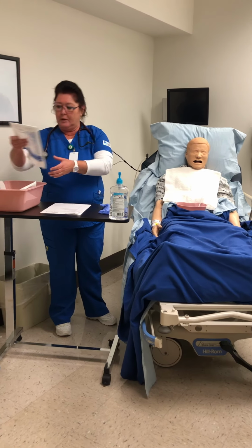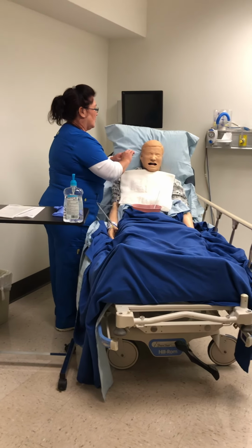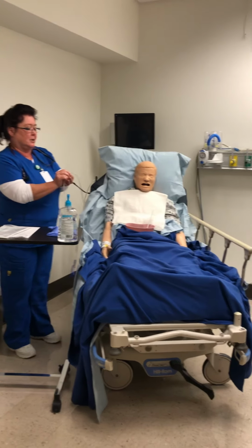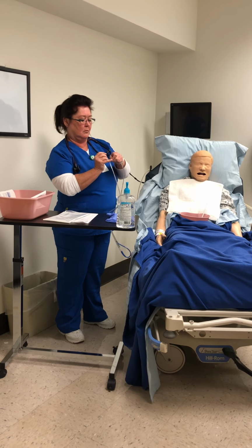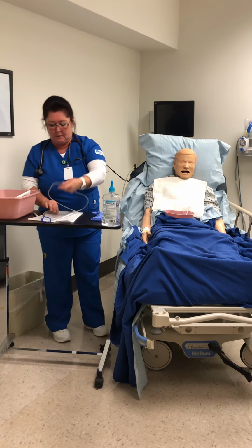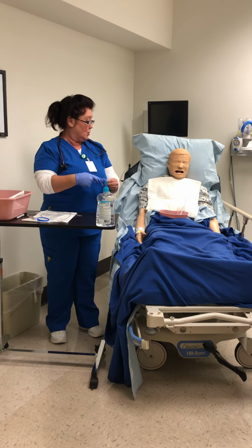And now I am going to measure the NG tube. And we are going to go from the tip of the nose to the ear, and from the ear down to the xiphoid process. And then I am going to mark my tube. And I am going to don my gloves. How you doing, Shirley? Okay?